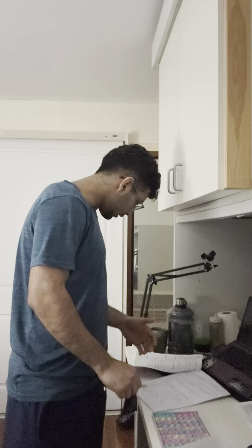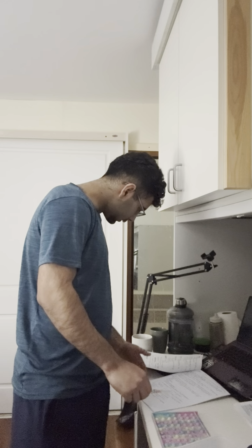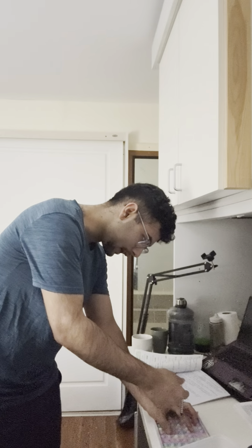You're going to tell her. So third check done. For subcut we have to pinch the skin to get the fatty layer. I'm going to hold it like this, take it out, and it goes in. I'm going to go slowly, and wait for some time, maybe 5 to 10 seconds, so that the skin can absorb everything.